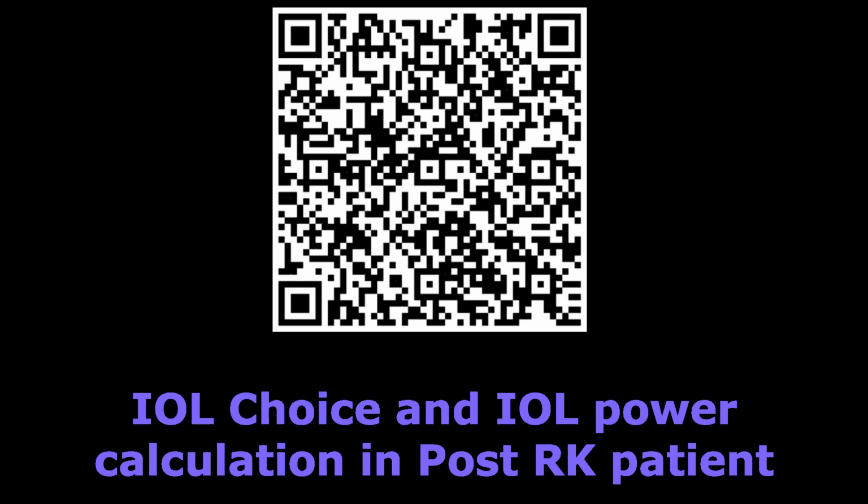The problem arises when you have a refractive surgery which has removed a portion of the central cornea, and this changes the thickness of the cornea and also changes the agreement between the anterior and posterior curvature of the cornea. However, in these patients, pre-refractive surgery details are never available, because usually these patients present to us at a very later stage and the biometry accuracy is always in question.